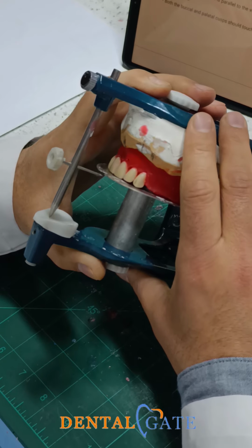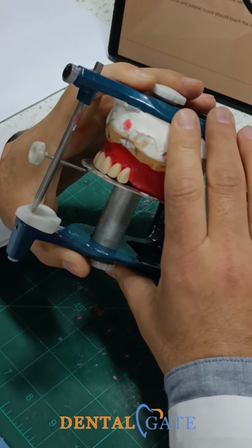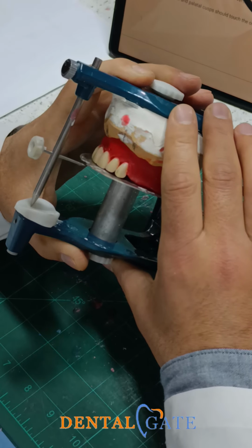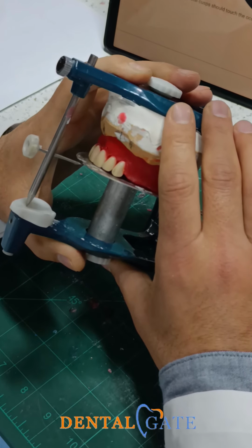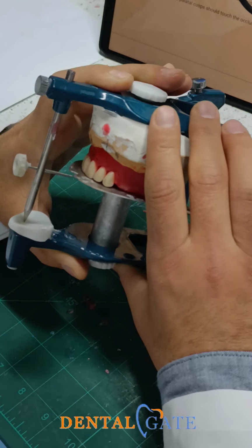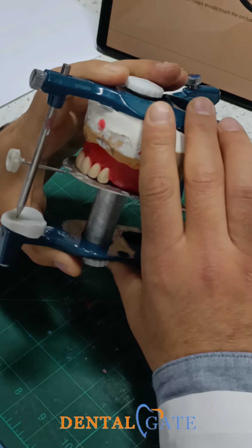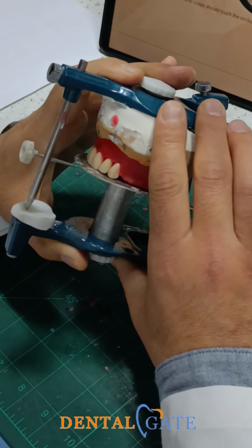Unfortunately, the arrangement of teeth regarding the posterior and anterior, we cannot put within one level because it will have a correlation with the mandible movement, because I want to establish the balance occlusion. Okay, so we need to make a curve.